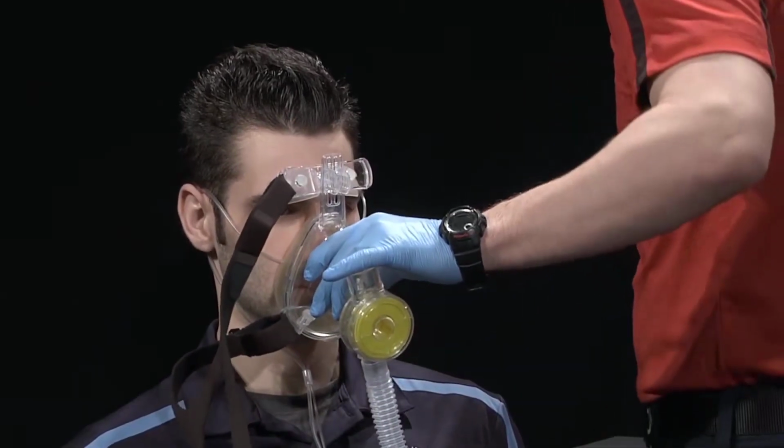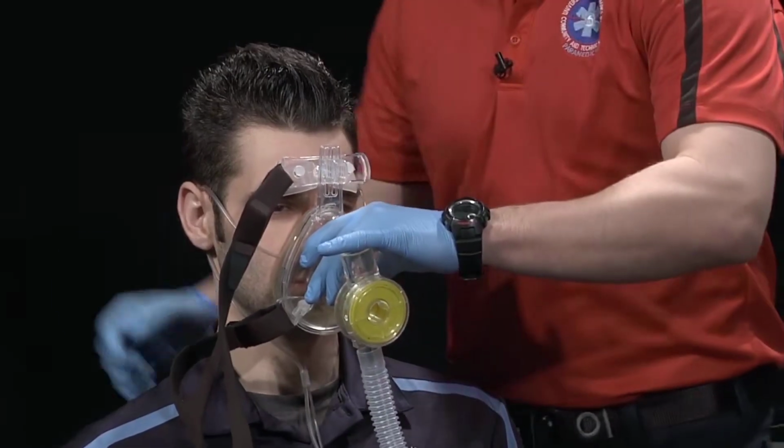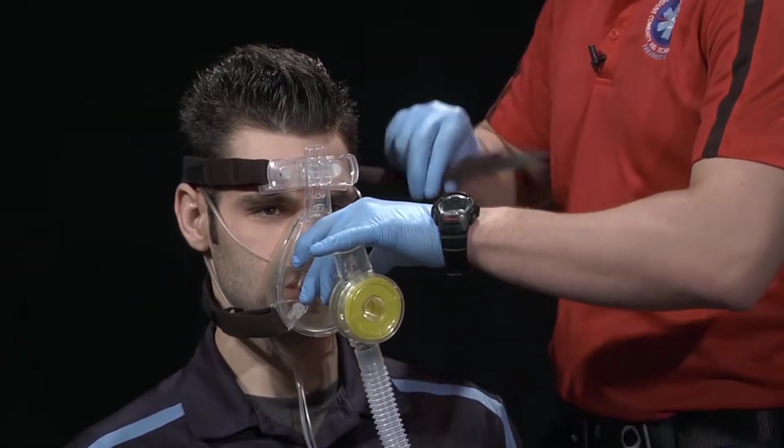We're then going to titrate our machine to the desired setting and then coach the patient to breathe normally and to adjust to the air pressure while securing the mask.